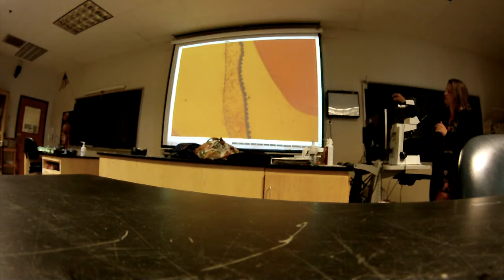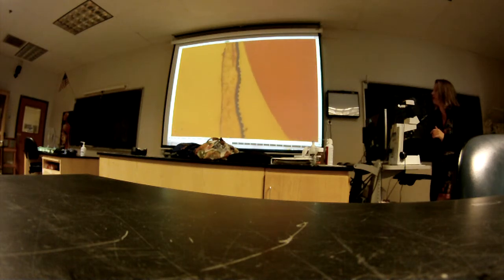This is the smooth muscle, if you're wondering, and the pigmentation is over here. And then there's an opening where the iris stops, and then it continues on the other side. It's a little tricky to just point to it and ask what it is, so I have to frame the question correctly so that you say pupil and not anterior cavity. I could say something like, what is this opening that this structure controls the size of?